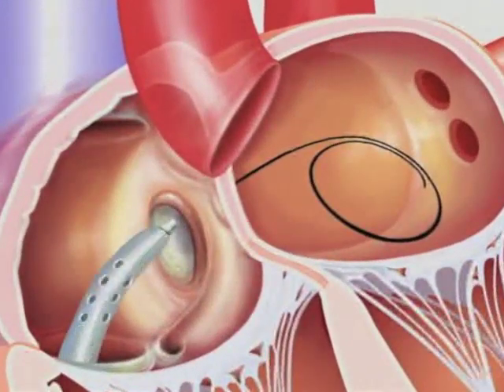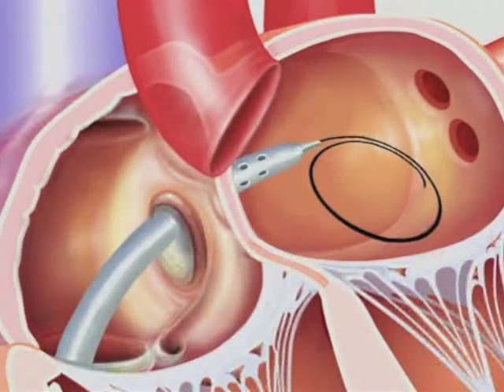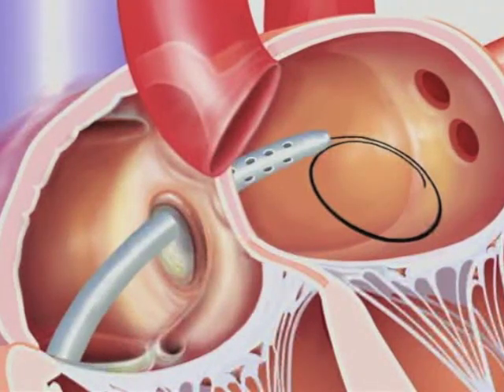The Tandem Heart can be rapidly inserted in the cath lab or operating room in as little as 30 minutes.